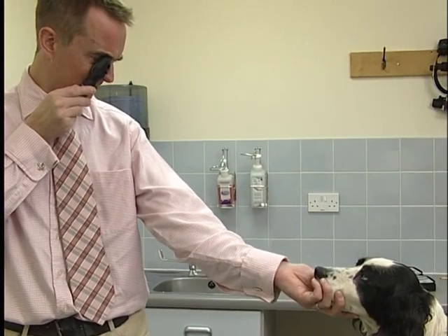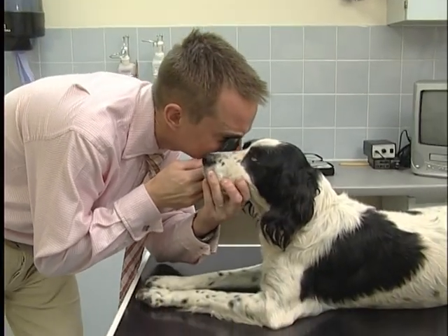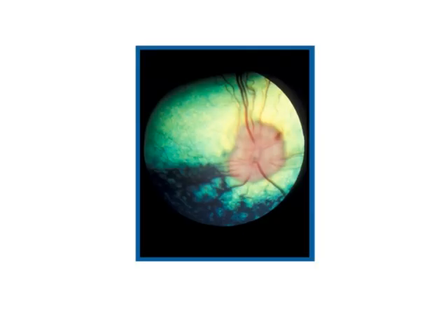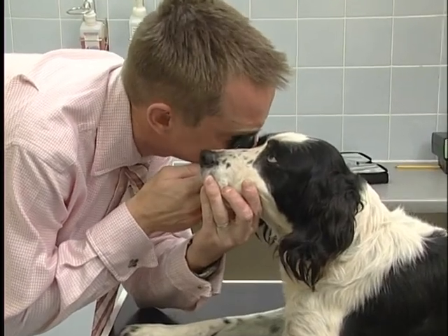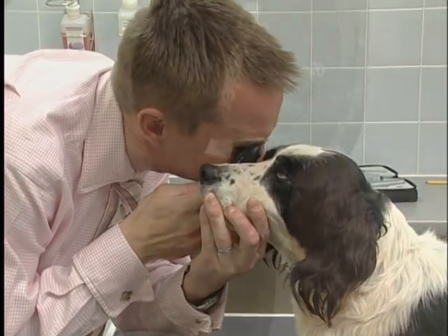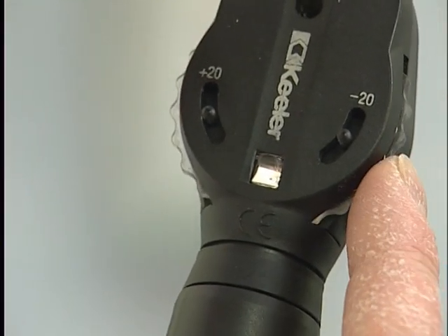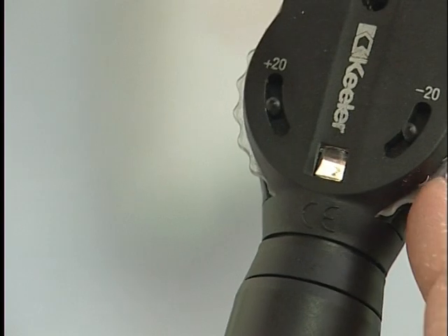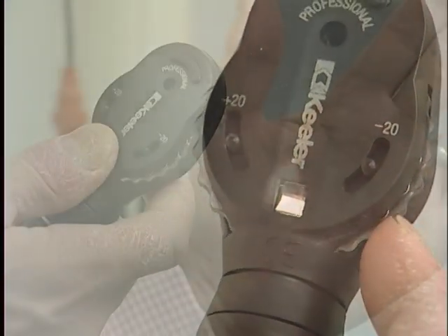The ophthalmoscope should be set up to the user's prescription. For a normally sighted person, this would put the diopter setting on 0 for retinal examination. The ophthalmoscope is then used as demonstrated in the video. In order to change the diopter setting, if the dial is rotated anti-clockwise, then more negative diopters are selected, and if it is rotated clockwise, then more positive diopters are selected.